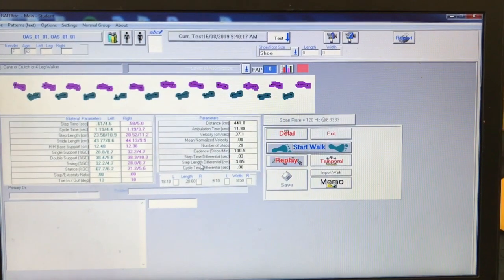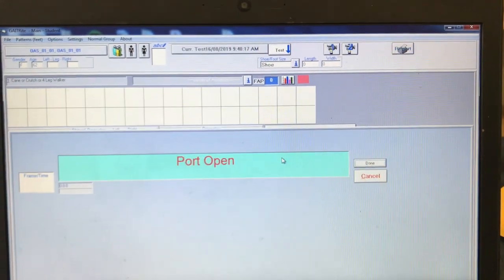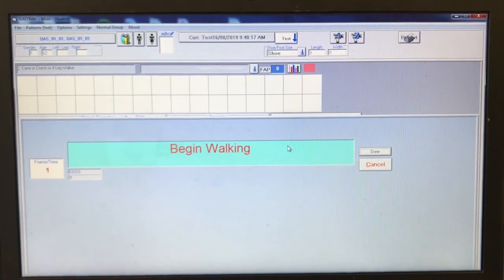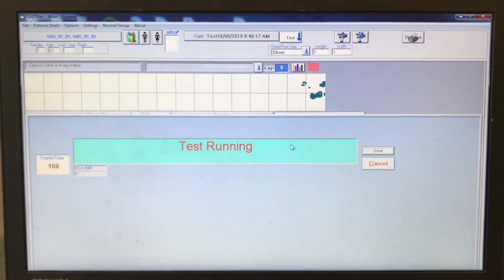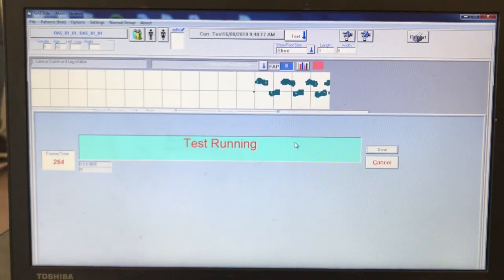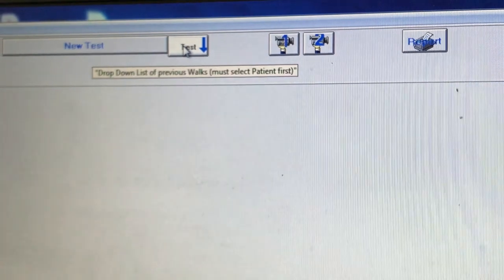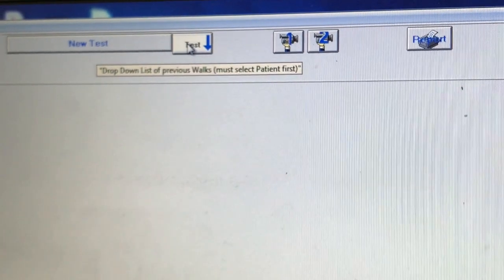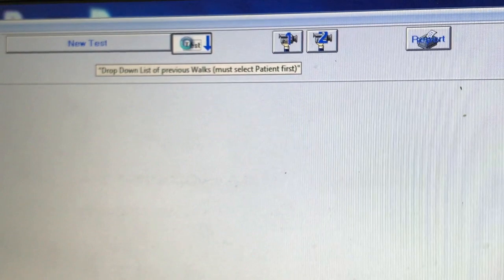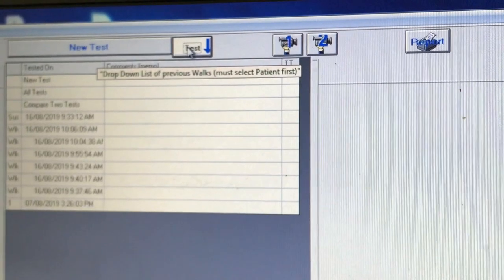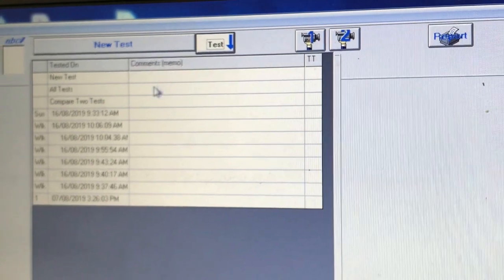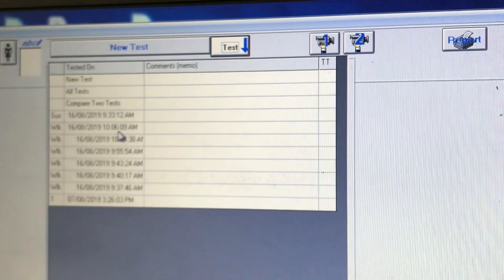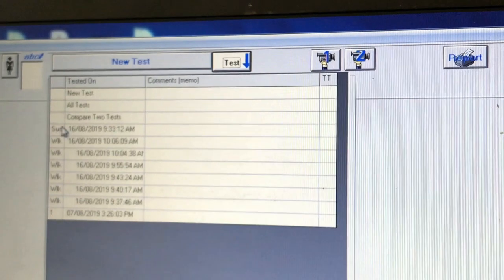Once you have saved your walk, you will now be able to click the start walk button again and repeat the previous process until you have four walks saved. Once you have saved your four walks, click on the box saying test with a blue arrow pointing down, located at the top of the page close to the middle. This will cause a drop-down list of all your saved walks to appear. If you had to suspend any of your walks, these will also appear with the SUS shown beside it instead of a WLK.